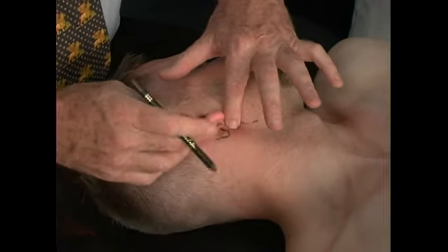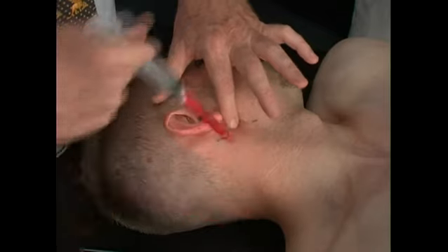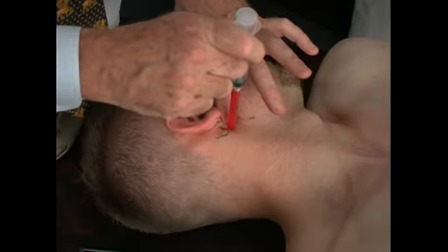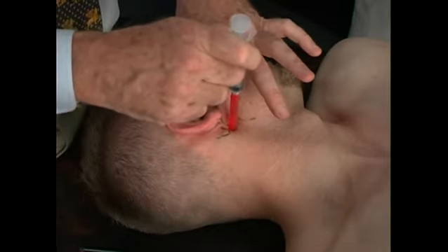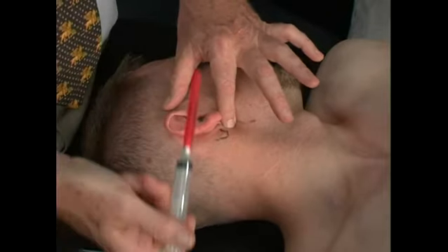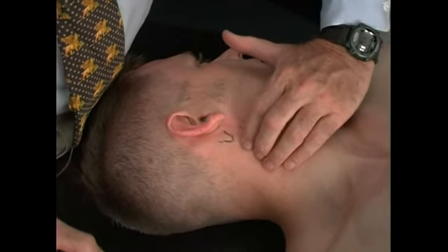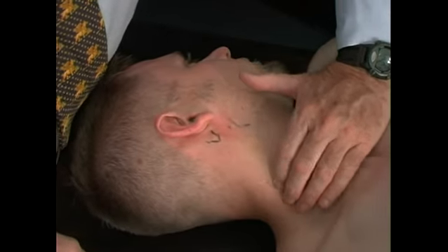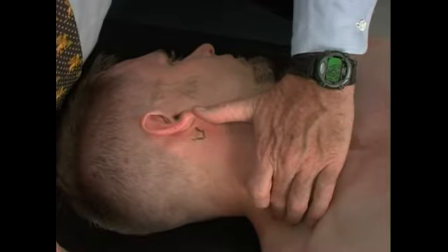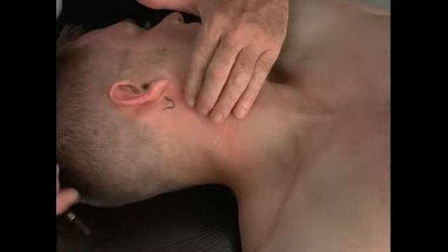We can push in this area and go with our injection directly down onto the tip of the transverse process at C1. This will not be a deep injection, and one should not probe deeply in here. The styloid lies right under this area. The transverse processes then form an angle, and then angle backward to the C7 transverse process, which, as we pointed out earlier, becomes more prominent and more posterior.